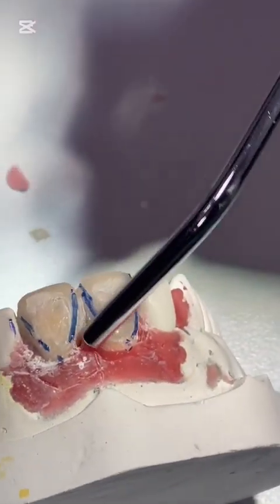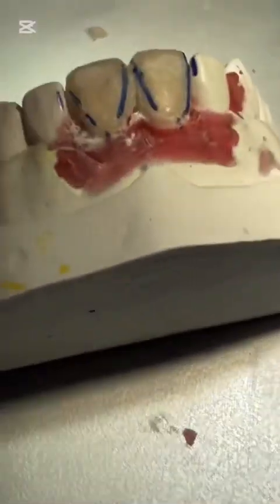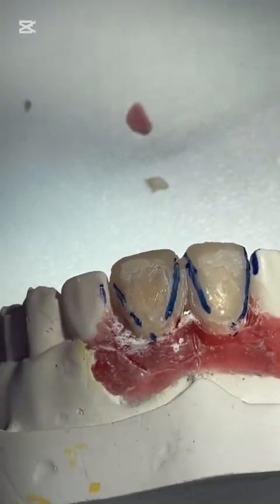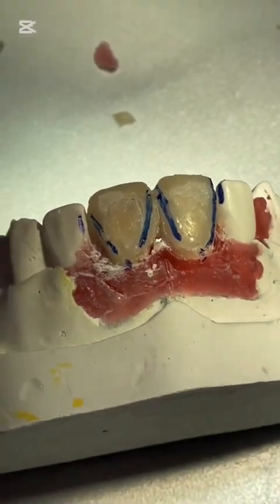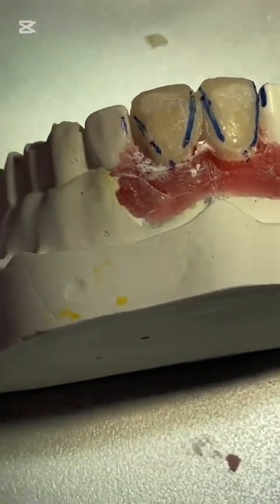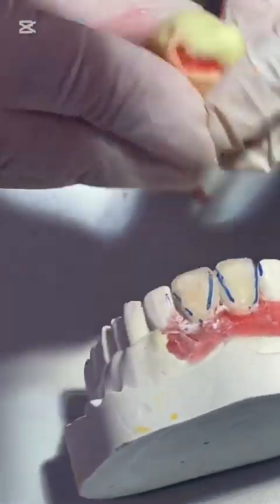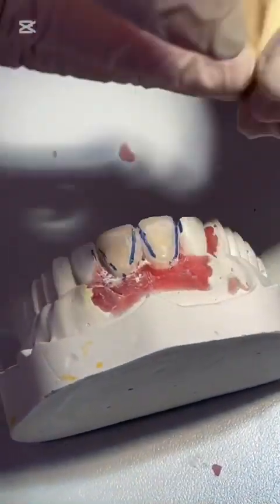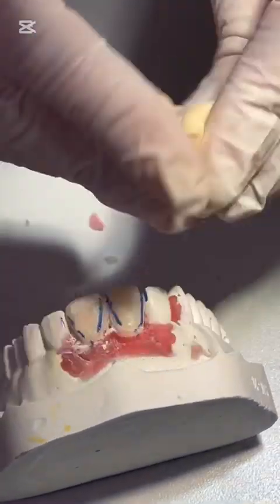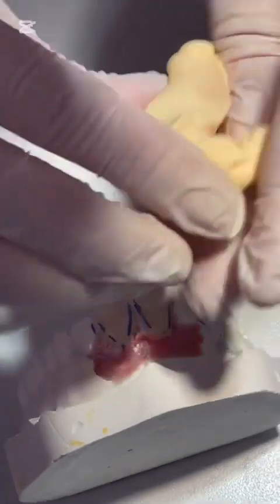Okay. Then I will take an impression. Now I mix it.